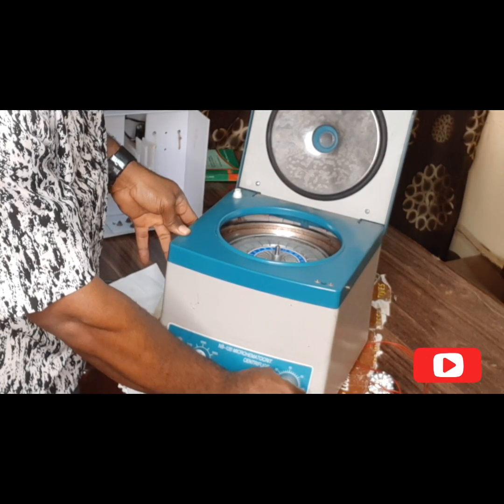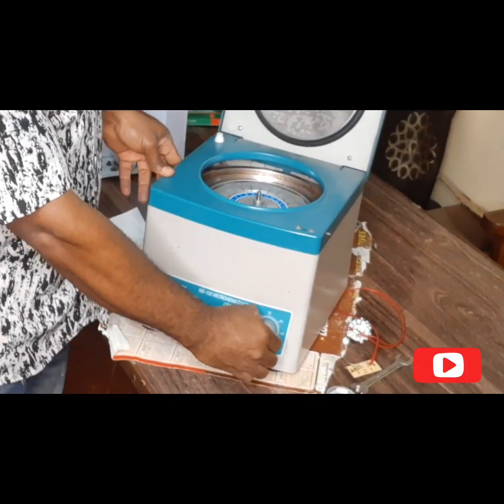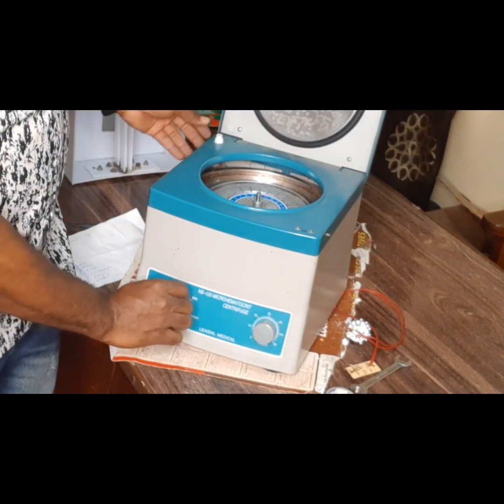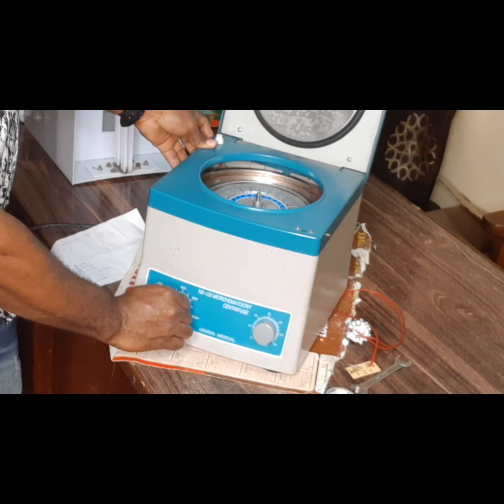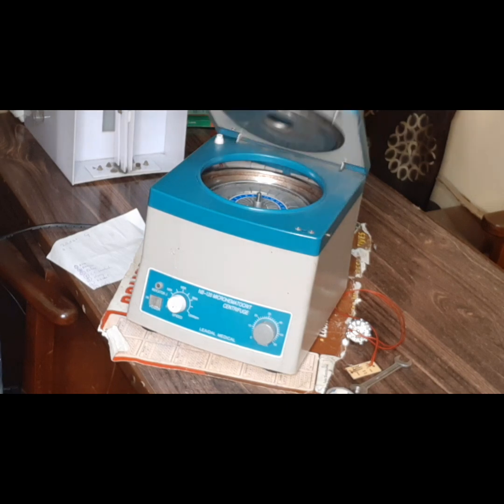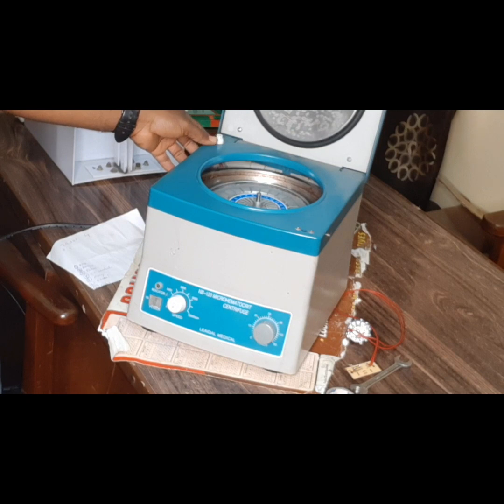I will first of all put the, I don't know if you are seeing it. Let me be sure. I'll put on the timer. This is a timer. And here is the power. It's powered now. Let me put it on a little from the regulator. Remember there is a switch here that will always be energized when you close this very part, the cover. It will energize this switch. So this cannot come on except you close this.